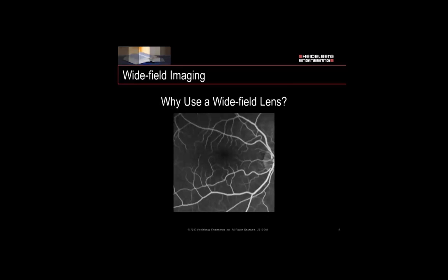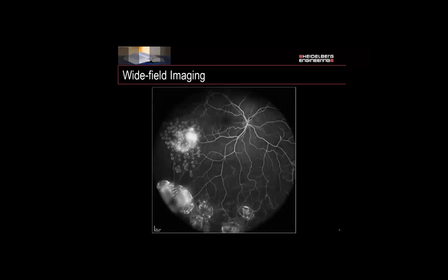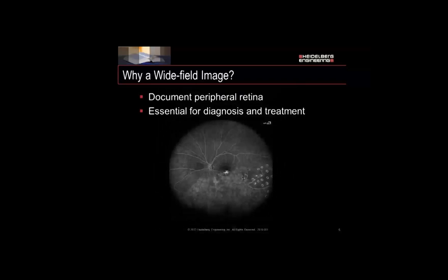Why do we use a Wide Field lens? Here is a photo of a 30-degree field view with our standard lens, and we can see very clearly the macula, the disc — a very unremarkable FA image. However, if you use the Ultra Wide Field lens during the angiography, you can see there is quite a few things to remark upon in this image. We do it to document the peripheral retina, and it's essential for doctors so that they can diagnose and treat the patient.